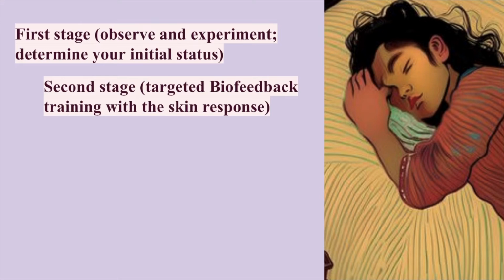We don't want our participant to know what is being collected, because if they're aware of the activity, that could lead them to change it. Like, imagine you're aware of your own breathing. You wouldn't be breathing normally.